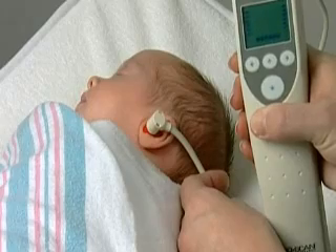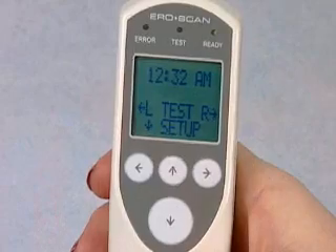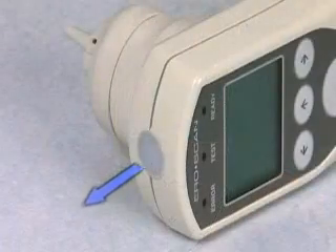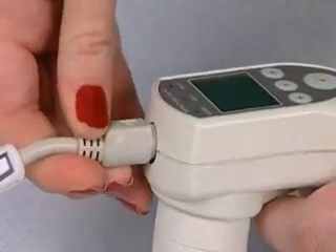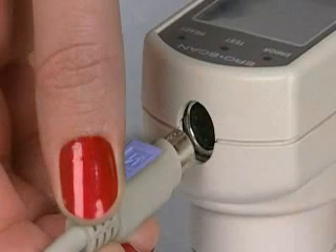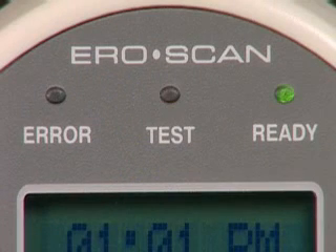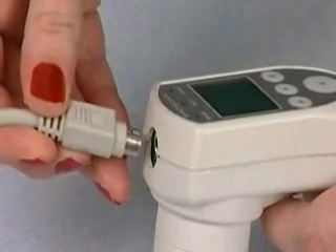For this demonstration, we'll be using the external probe on a newborn. To use the external probe, turn the AeroScan off and remove the protective cover from the top of the unit. Then plug the external probe connector into the external port, taking care to align the connector with the flat side facing the display. When turning on the AeroScan, the yellow test light will illuminate briefly to indicate the AeroScan has detected the presence of the external probe. If the yellow light does not illuminate, remove and then reconnect the probe.